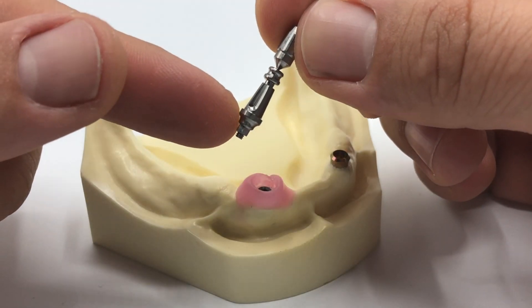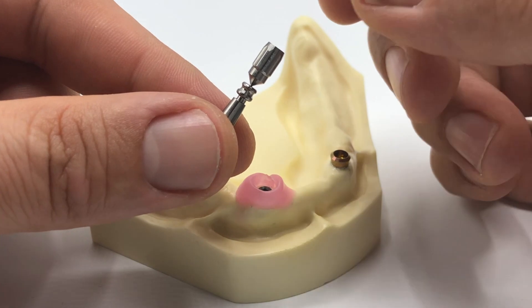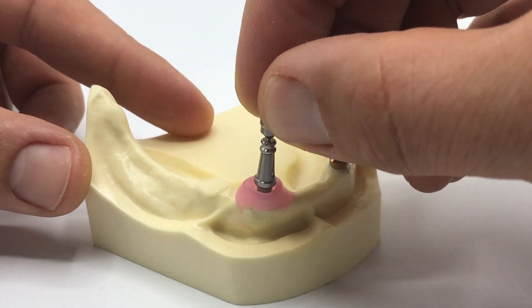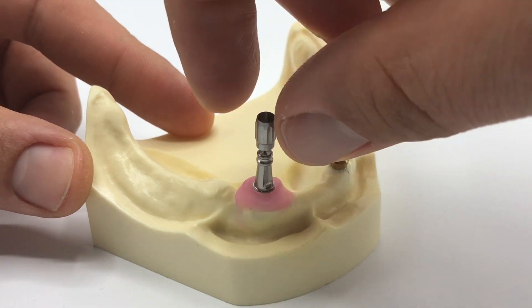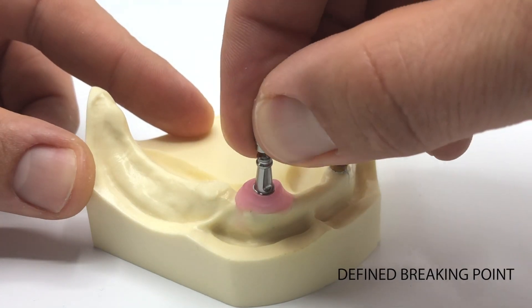Come on, I'll show you how that works. This is the abutment itself. On top you can see the impression screw with its handle. Use the handle and hand tighten the 2-in-1 impression abutment easily into the patient's mouth and break the handle off.